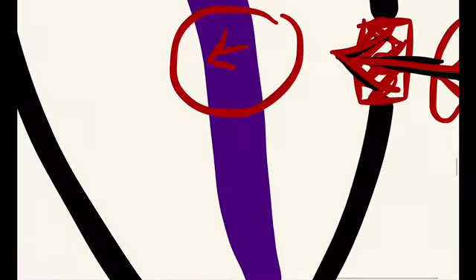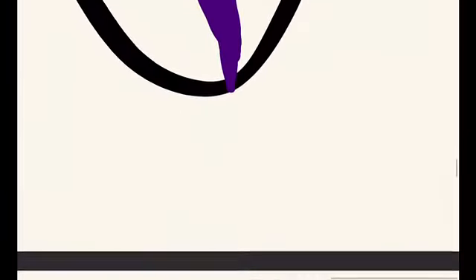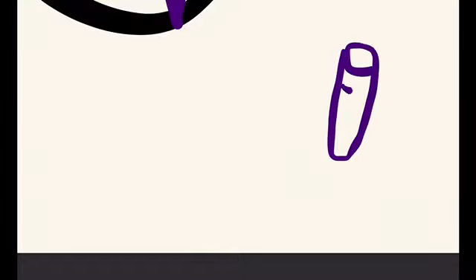Because of the death of the tissue, first it creates a window which gives us the Q wave. The second thing it does is that this dead tissue also originates a depolarization wave. Friends, are you getting my point? This is a very important part.